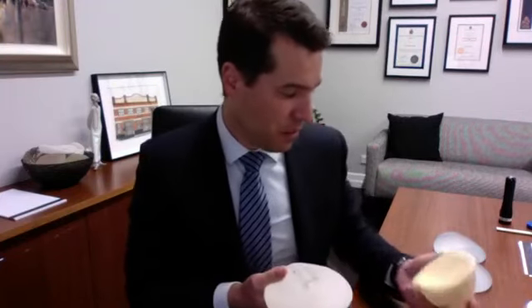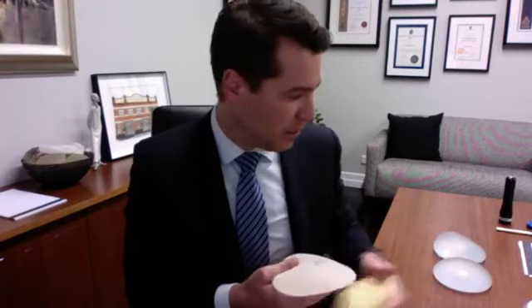It was a clever design. It was a good implant in terms of what it was able to deliver, but unfortunately it does have a macro textured surface, and the incidence of ALCL in that particular surface is hovering, depending on what you read, and I tend to follow the work of Anand Deva and his team, we're looking in the 1 in 3,600 sort of territory for a macro textured or grade 4 device. Some of the polyurethane devices, some of the Silimed type devices in terms of the macro textured surface are also in that category.